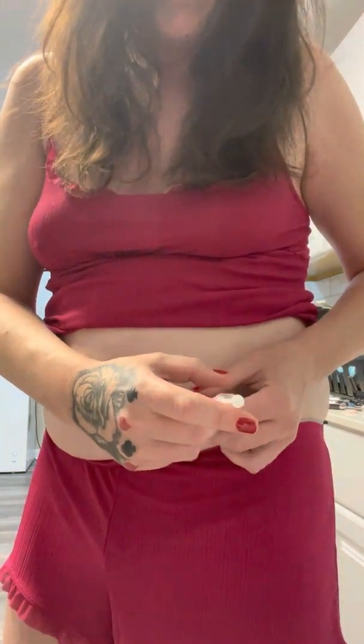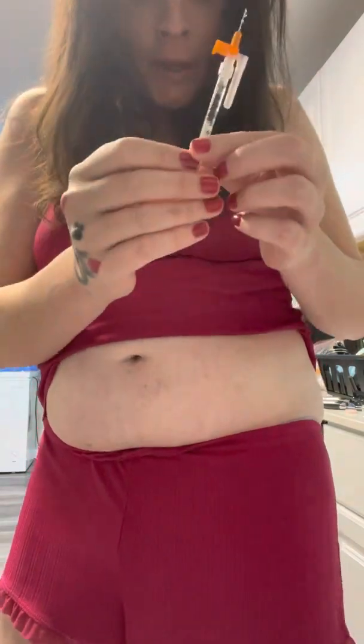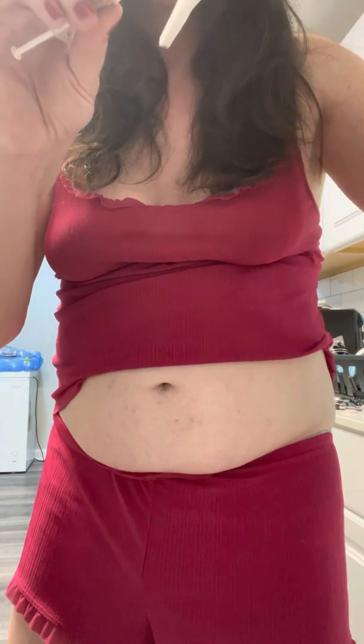Here comes the big part — it's not that bad. I am going to go three, two, one, and poke. Take your time with it. Once you have the needle in you, you can take your time pressing it. There is still a little bubble in there, just trying to get that bubble out. In this situation I'm going to go ahead and draw a little more solution. That was a little unexpected, but I am at the very bottom of my serum, so it is easy to get air into the syringe.